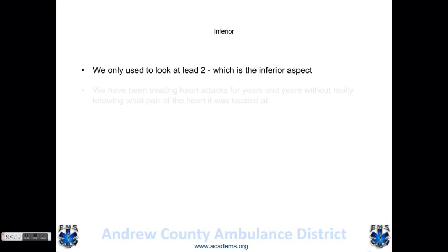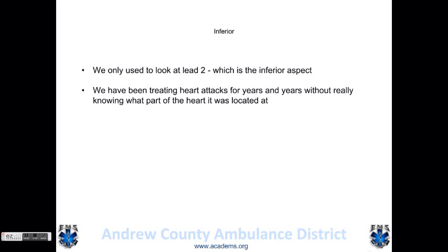A posterior MI. Now when we talk about the inferior MI, I want to stress that we only used lead 2 for a lot of years. We didn't have 12 leads. This is the inferior aspect. So anytime we saw elevation in lead 2, we were seeing an inferior MI every time. And we've been treating these heart attacks for years and years without really knowing what part of the heart it was located or caring.